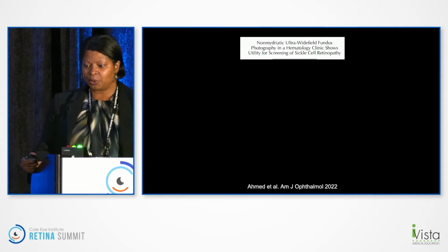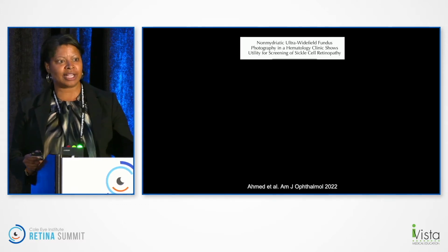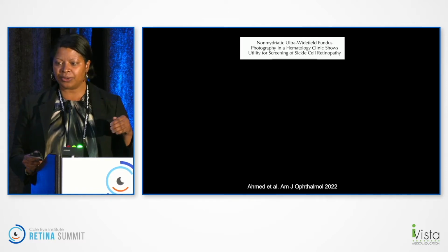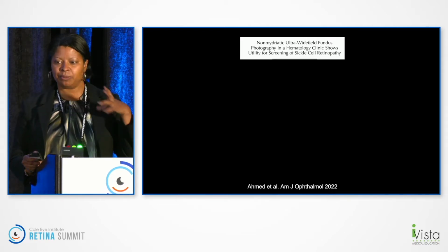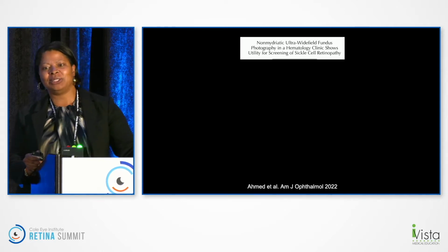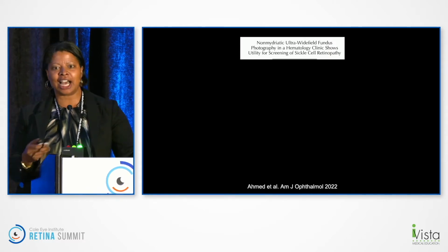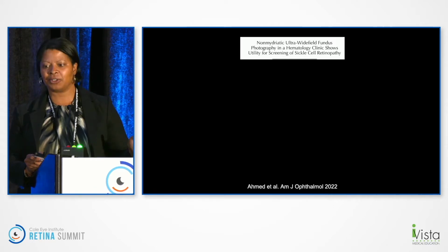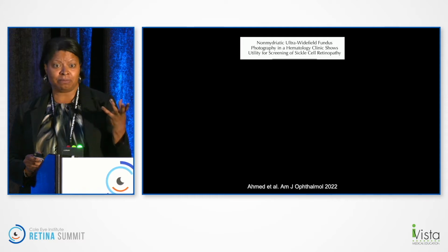We put the camera in and imaged sequential patients with a known diagnosis of sickle cell disease. The medical student, the coordinators, and the team there worked with me to take these pictures. We published this in the AJO to ask: can we pick up sickle cell retinopathy in a non-mydriatic setting in a hematology clinic, by non-professional photographers? Can you give somebody limited training, and can they take a decent wide field photo where you can make a diagnosis of disease?